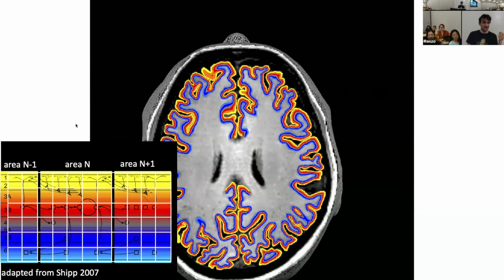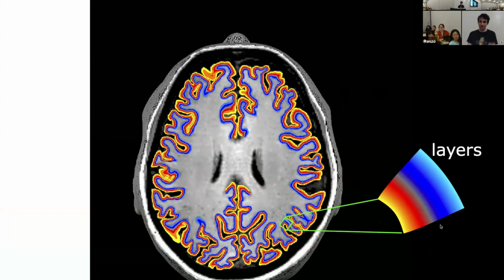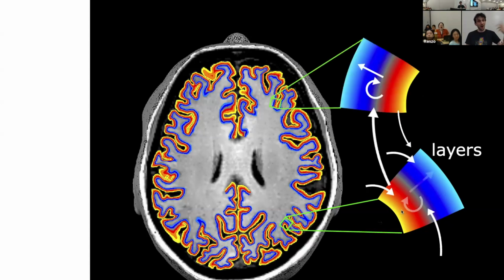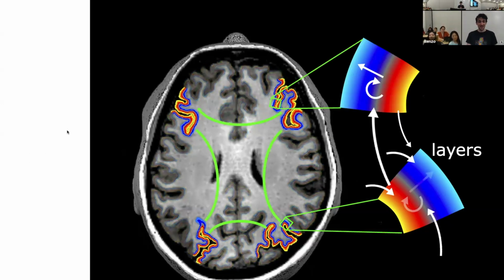which is giving us important new information for understanding how the brain works, namely in the sense that we not only learn if a given brain area is involved in a certain task, but we learn something about where this activity is coming from, how it's following the different processing steps, how it's modulated by input from other areas until we have a new output of this computation with respect to feedback and so on. So going from conventional resolutions to high resolution not only tells us which areas are connected to each other and which of those connections are stronger than others, but importantly, it tells us something about the causality, the directionality of these connections, which is useful information to have.